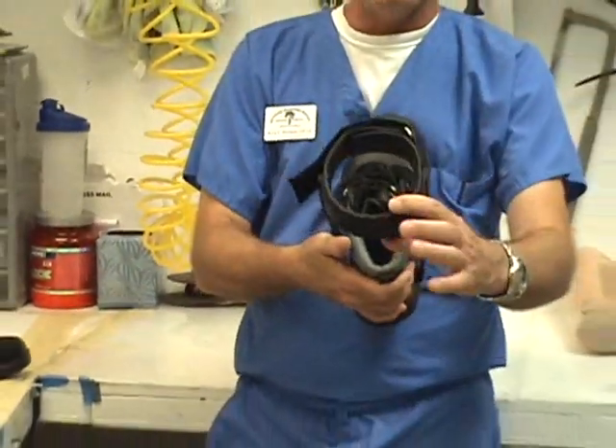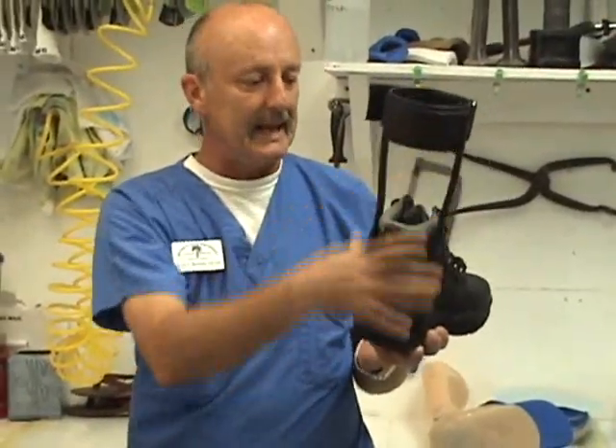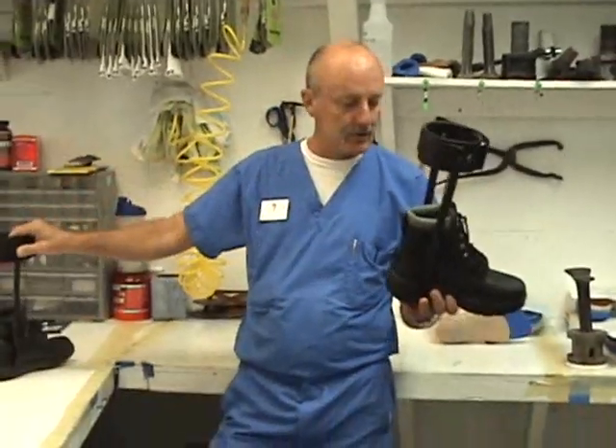Basically it's a leather cuff that goes around the calf. None of this metal touches the leg anywhere. This one is attached to a boot, but we also make them attached to shoes.